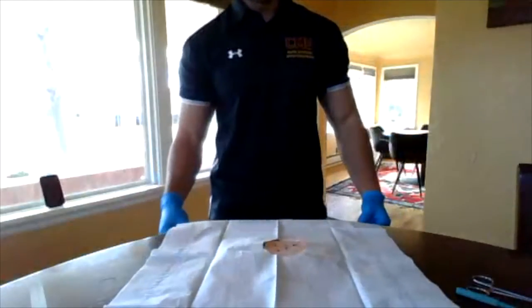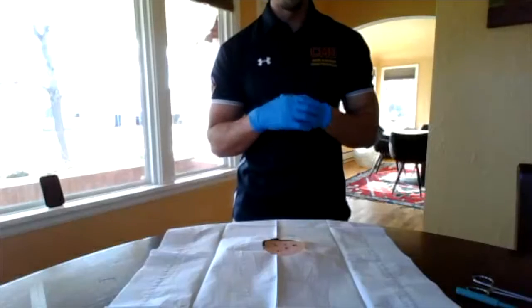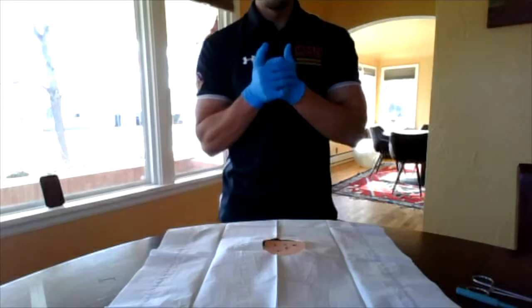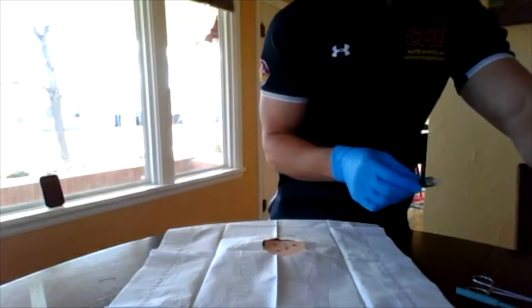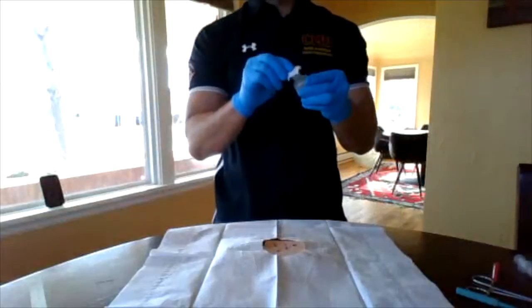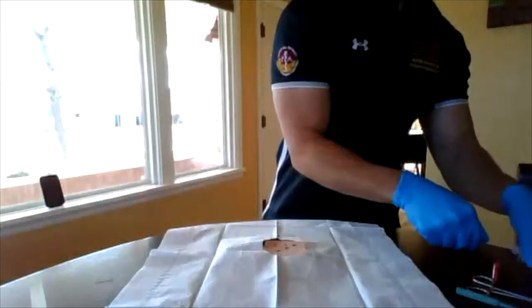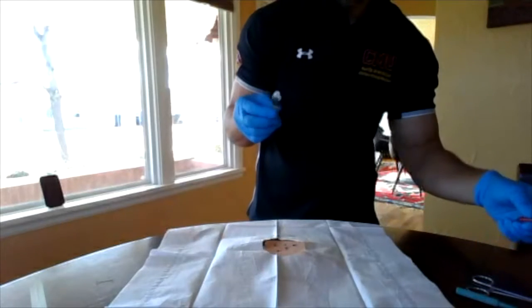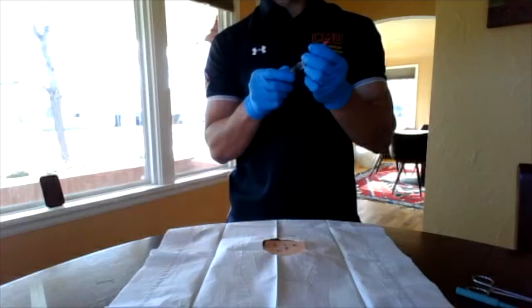All right, so now that we have that done, the next step in this procedure is to draw up lidocaine with or without epinephrine. All right, so we use an alcohol swab to wipe off the top of the vial, sterilizing it. And then we will grab our 3 milliliter syringe, and we'll grab our 21 gauge blunt needle.